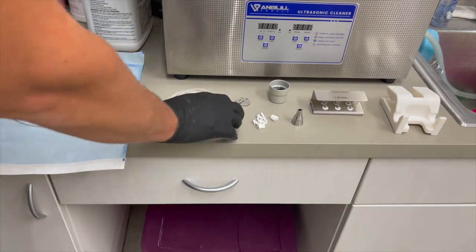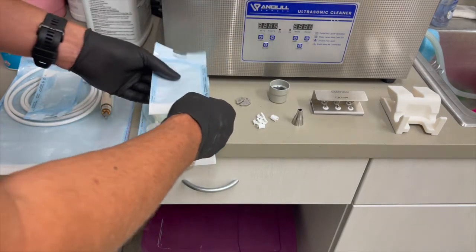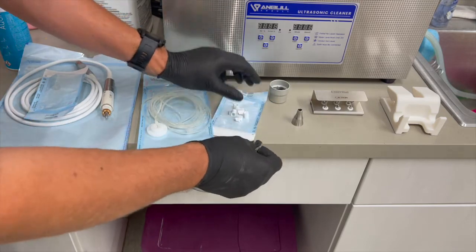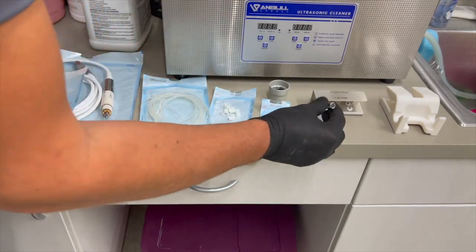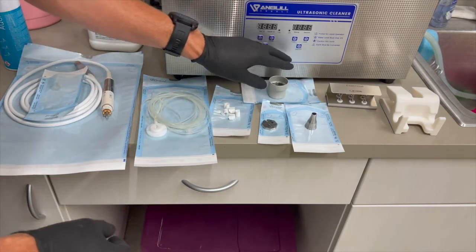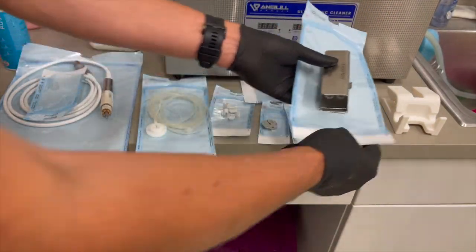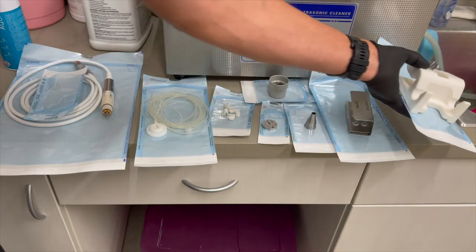That assembly can be put into the autoclave — go ahead and bag it. You'll bag your line holders, your wrench, your nose cone, your deep wrench, your tip kit with all your tips, and finally your holder for your handpiece — each in their own bag.